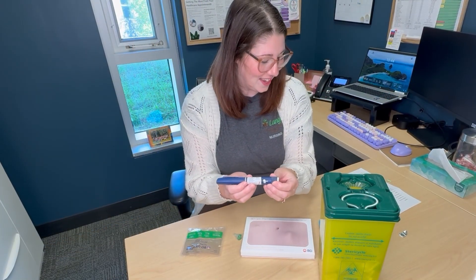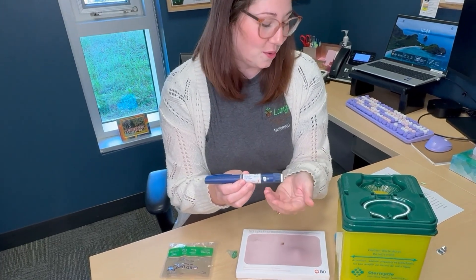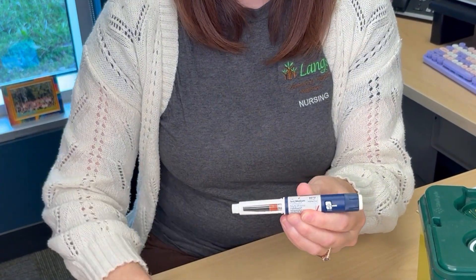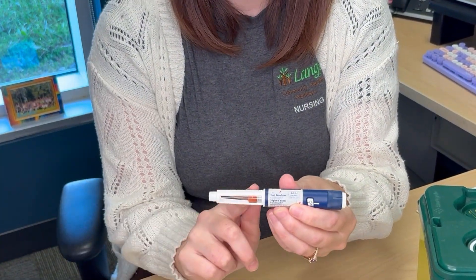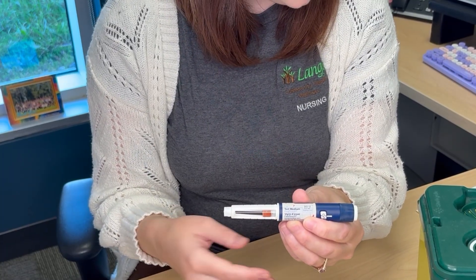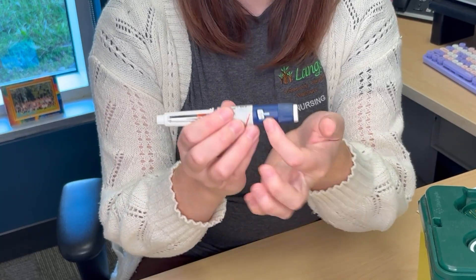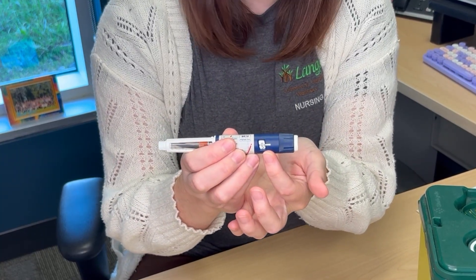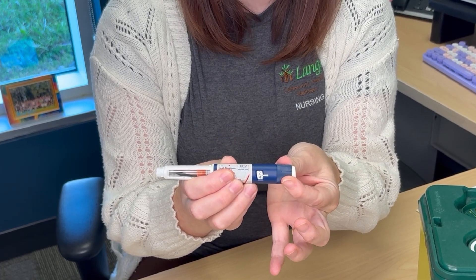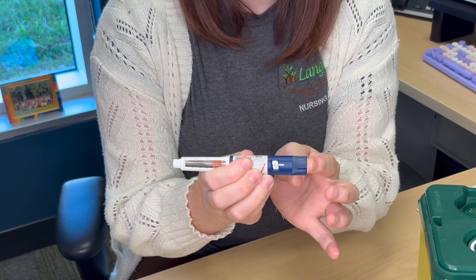First, look at the pen that you're using and make sure it is the right type of insulin for that time as ordered by your team. Then remove the cap. You will notice that the insulin cartridge is pre-loaded into the pen, making it ready to use and easy. On the end of the pen, there is a window that shows the number of units you are taking, a dial where you can adjust your dose, and a button to administer the insulin itself.